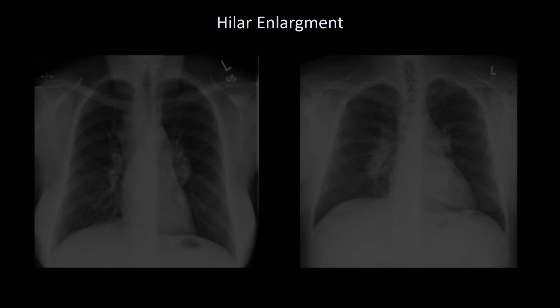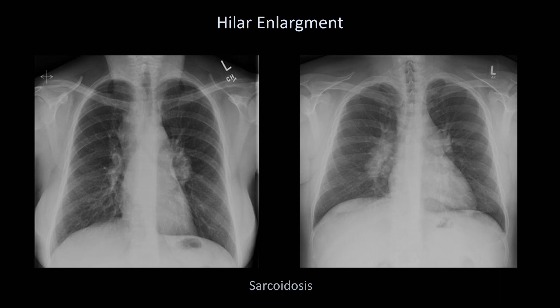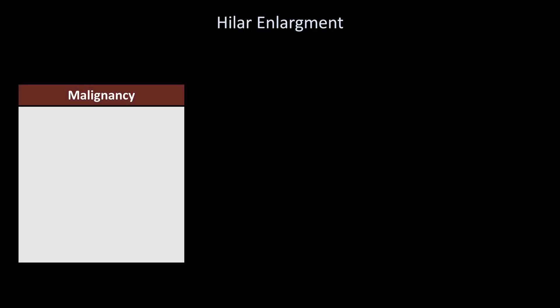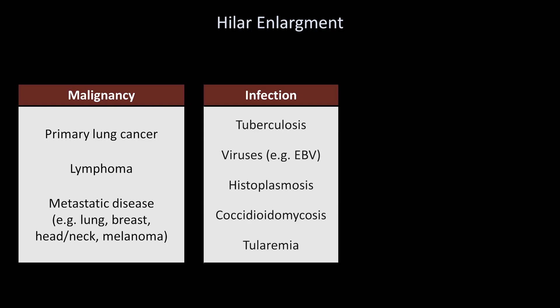I will move on from the mediastinum to talk about the hila. Here are two examples of bilateral hilar enlargement — in this case, both patients had stage 1 sarcoidosis. The differential diagnosis of hilar enlargement is very long and can be divided into three categories. First, malignancy, which includes primary lung cancer, lymphoma, and metastatic disease. The second category is infection, particularly tuberculosis and viruses, but a whole host of rare diseases are included here as well. Depending on where in the world you are practicing and watching this video, there may be many more diseases on your list.